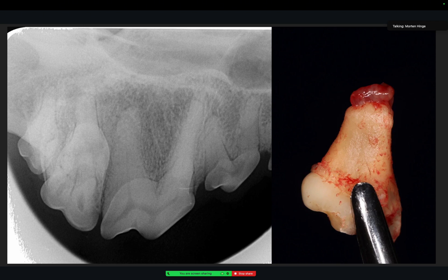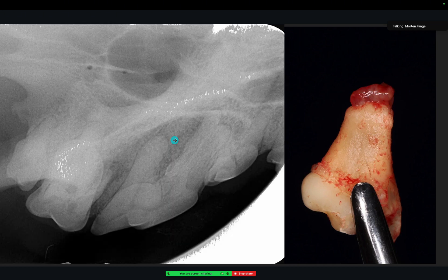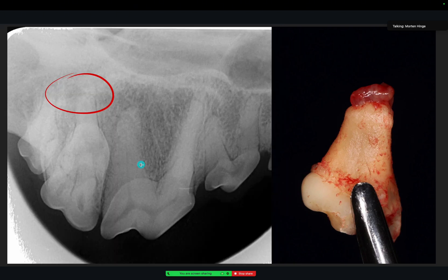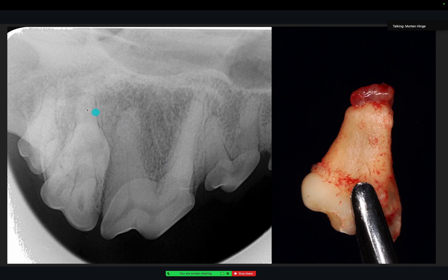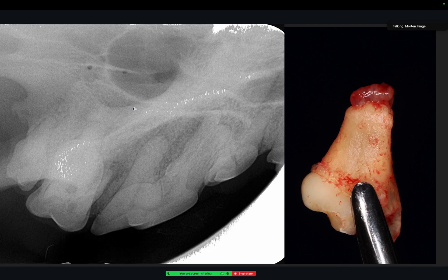This is an example of how tricky it can be to evaluate. This was actually normal and normal, but the palatal root of tooth 109 had a big granuloma — right here — very hard to see. When you take some different projections, you may with some good will see there may be something here, but it's not really convincing. But this one is more convincing — you can see the area here, so this also had an apical problem. If you have a CT scanner, this is obviously easier to see than on a dental x-ray. The reason for this was a crack in the crown.